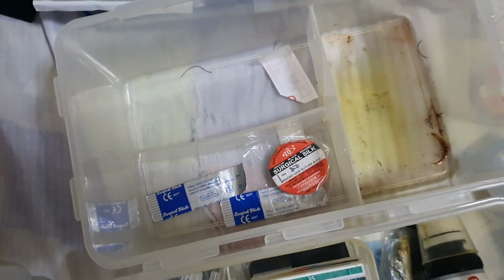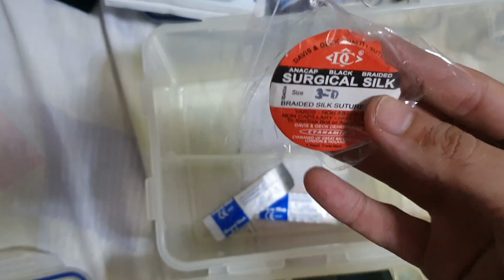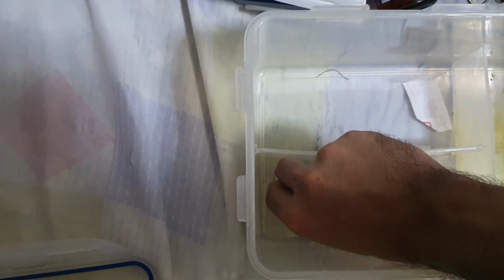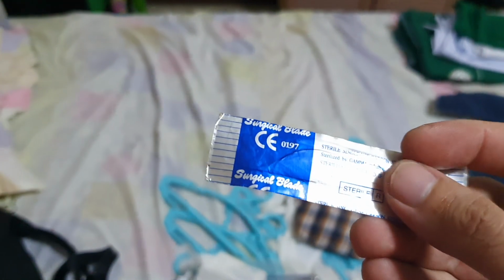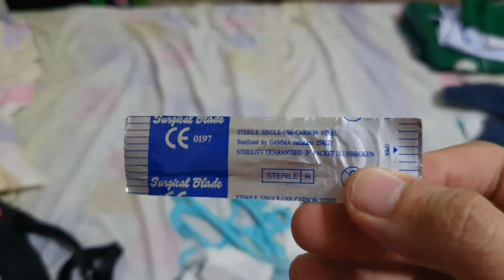Oh yeah, and also I have one piece of surgical silk here, or the surgical thread, and also this is the sterile surgical blade. This is very, very sharp. This is used for incising tissues if we're going to do apicoectomy, and also different surgical techniques that you're going to use.